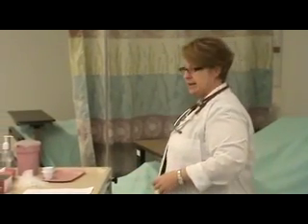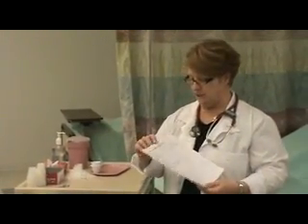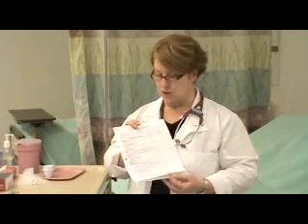Another thing that you're going to need to have handy is your administration of medication via feeding tube return demo sheet, and this is available on Blackboard as well. There are certain aspects of it that were written to go with nasogastric tube medication administration. What we want to show you when we get to the patient's room is actual G-tube, gastrostomy tube medication administration. So we'll point that out as we move along. So at this point, let's get started.